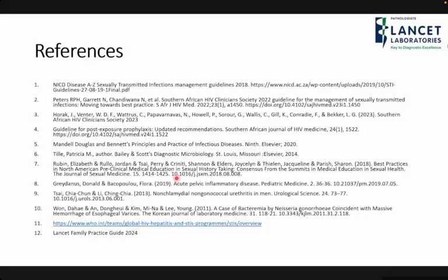Some clinicians, because they know there is a problem with Neisseria gonorrhea, that it's a fastidious organism, even ask for a plate, and as soon as they swab the patient they plate it out on the chocolate agar plate, and then send it to the lab as soon as possible. So we do see Neisseria gonorrhea, and we do see positive cultures, but the sensitivity is low. From the ones that we see, as soon as we grow them in the laboratory, because we know the environment where this organism should grow, we do sensitivities.